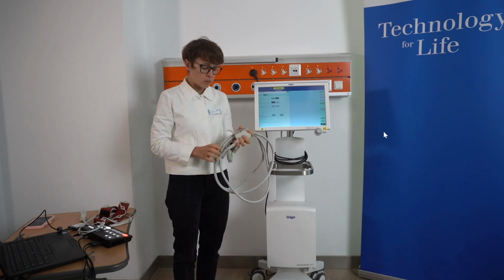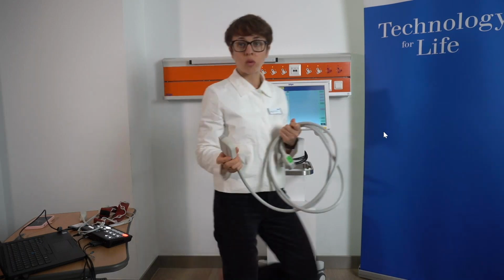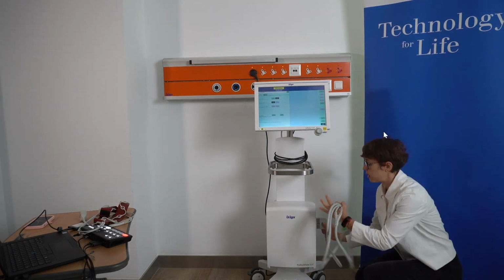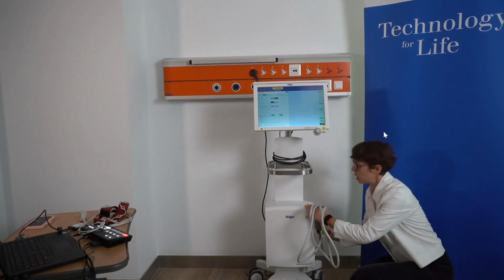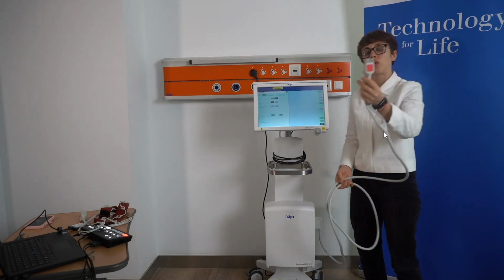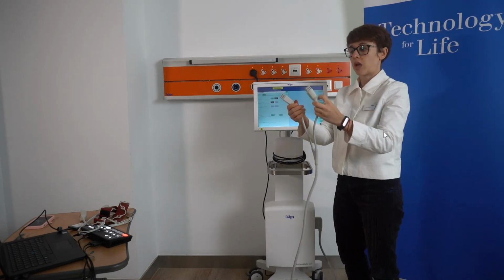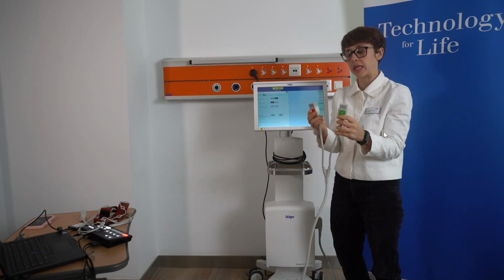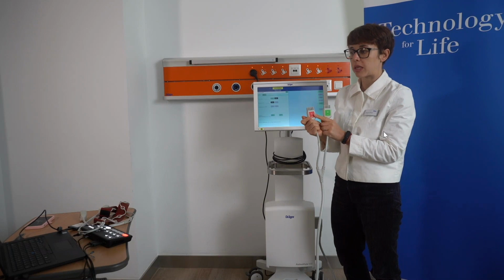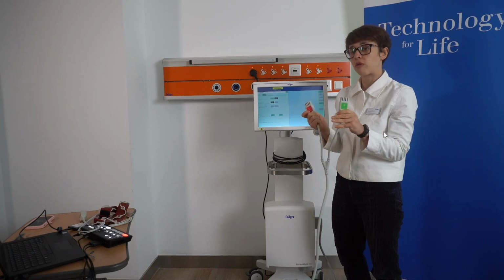When we start the device, we of course need to connect the cable trunk to the main unit, and then we have the color-coded two belt extensions. On one of them it says R, and on one of them it says L. So this is the right and the left.